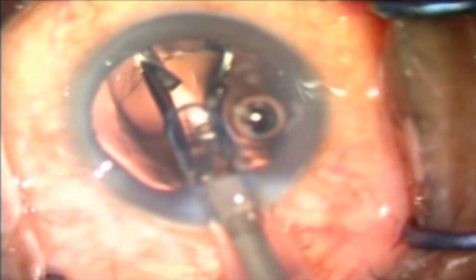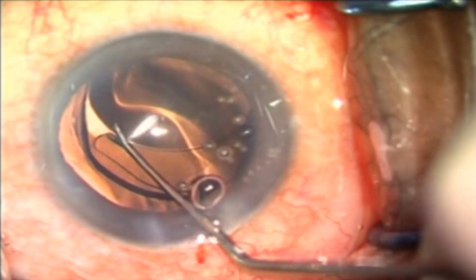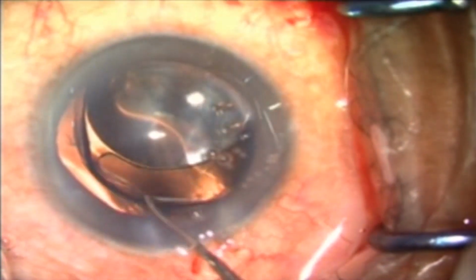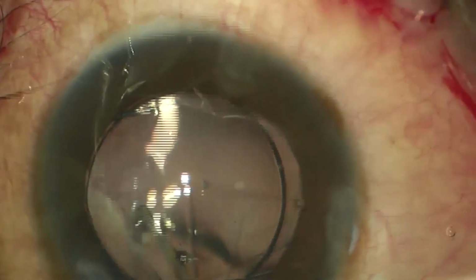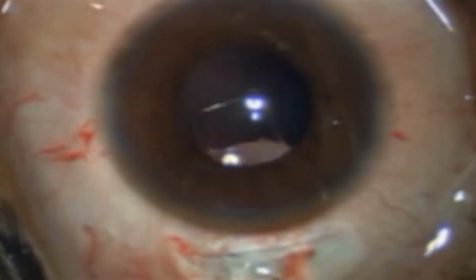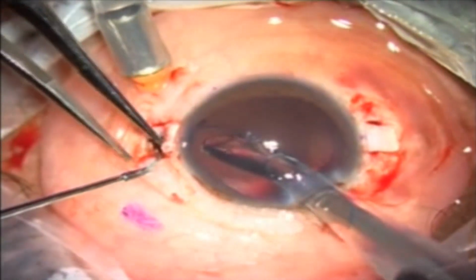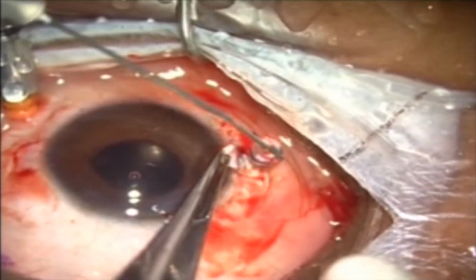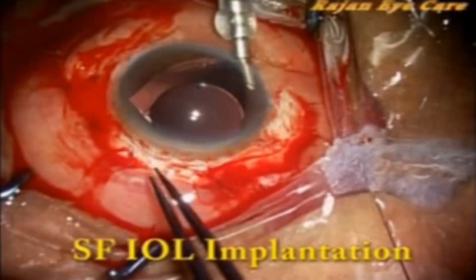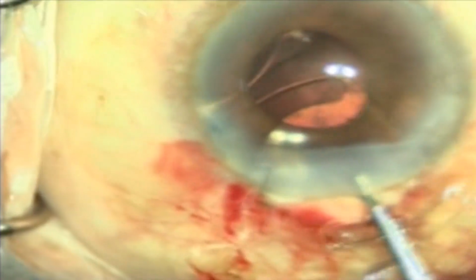After effective and complete anterior chamber vitrectomy, a foldable IOL can be placed in the bag if the PC rent is small. In large tears, multi-piece intraocular lens with optic capture can be done. In very large rents, a retrofixated iris claw IOL, a glued IOL, or a scleral fixated IOL or an anterior chamber IOL can be performed.